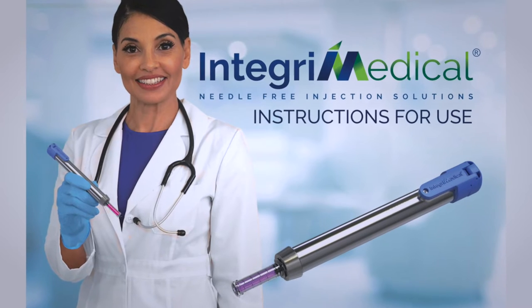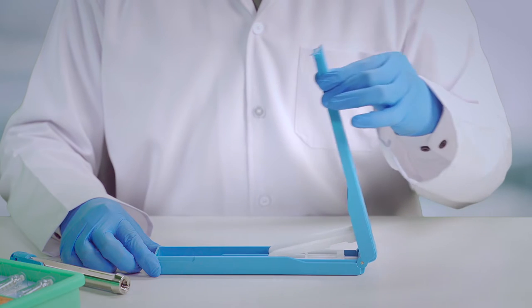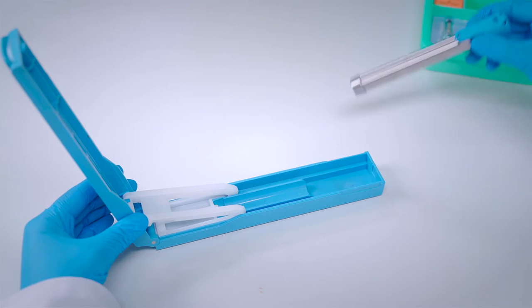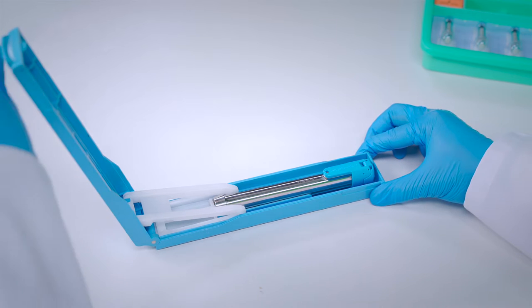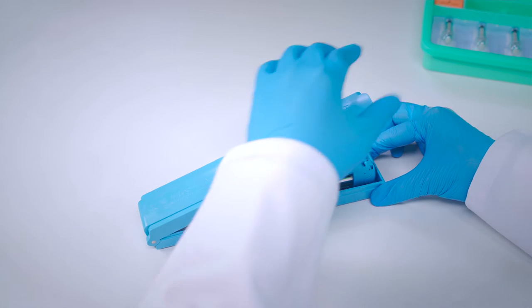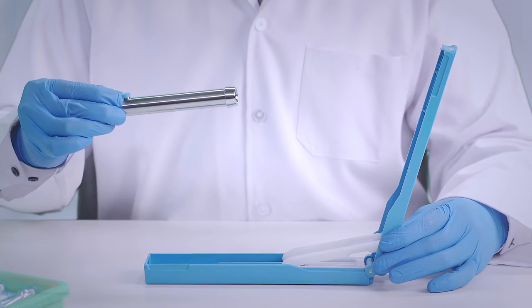We will now demonstrate how to operate the product. Step 1: Preparing the NFIS device. Open the loader until fully extended. Insert the NFIS device with the logo facing upwards. Using your palm, firmly push down the loader's top lid where indicated. Open and lift the NFIS device. The device is now loaded and ready to use.